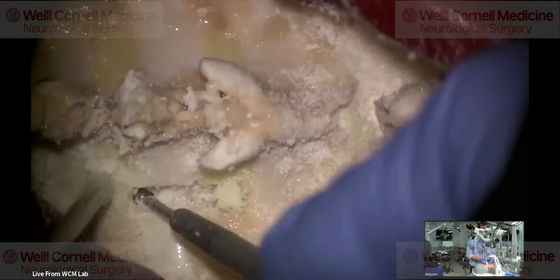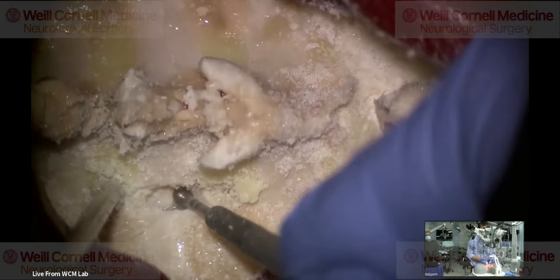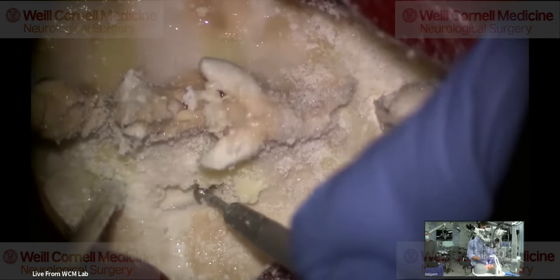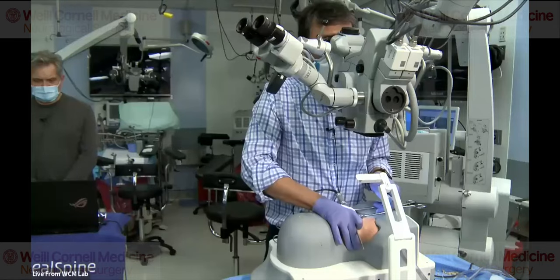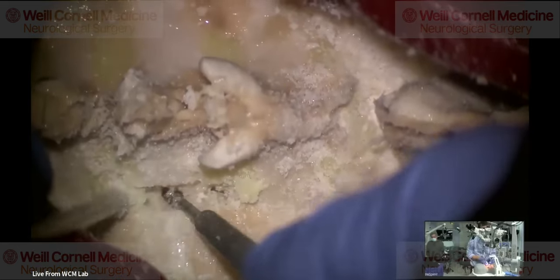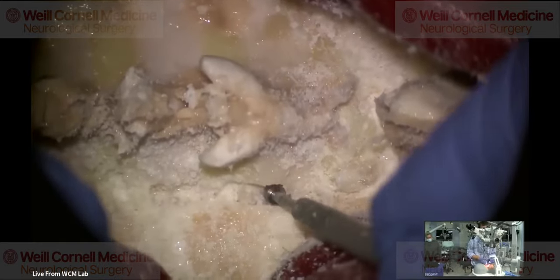So that's the second cut. And then the third cut is now the gingerly cut. In order to avoid epidural veins, what you want to do is make it thin, but not go all the way through. And if it's a good amount, it'll crack with the last one. I think that's almost ready. So that looks like I'll just leave that and then go on to the next one. So again, first cut is safe. You can go pretty deep.